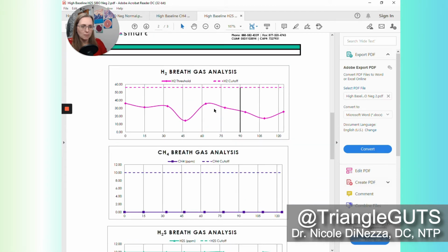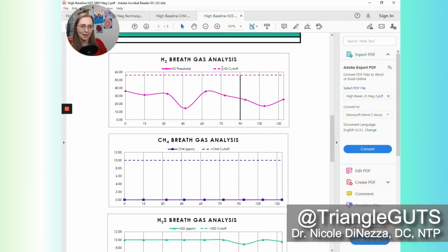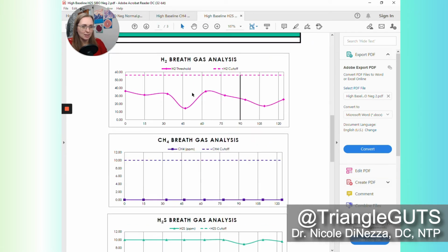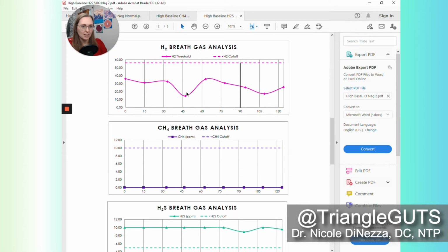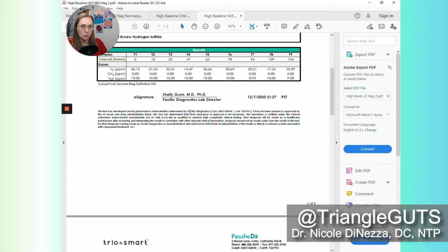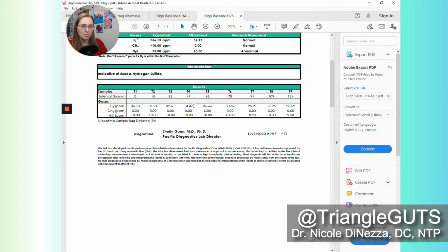We go ahead and scroll down, and then we've got another weird hydrogen cutoff. Look, the cutoff this time is 56.13. Lord knows why. But nonetheless, we can glance at that, and apparently they're deeming that as normal for whatever reason. Now, I will say, if you look at the peak, let's see, about the 45-minute mark, the hydrogen goes from 15-ish to 35-ish. So that would actually classify as SIBO if we were using the other ranges.